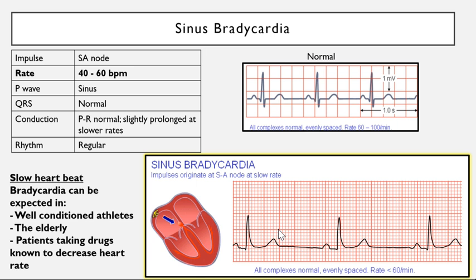And so when you go through that flow chart, you're going to be looking for those 4 things to determine what's going on here. You look at the box to box and then calculate it, and you'll see that it is less than 60. But everything else looks pretty normal, right? You've got a QRS complex. You're originating from the SA node. Everything looks very drawn out, but other than that, it's a normal PQRS, and it's a normal ECG. It's just very, very slow heartbeats, right?